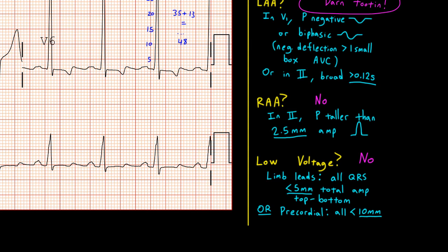Putting it all together, the key findings on this EKG are left ventricular hypertrophy and left atrial abnormality, likely stemming from long-standing hypertension. That's all I've got for chamber abnormalities. Be sure to tune in next time when we talk about the all-important ischemia and infarction.